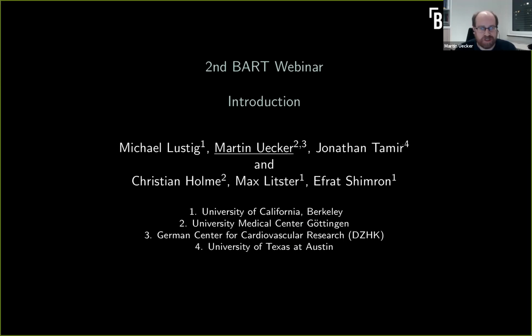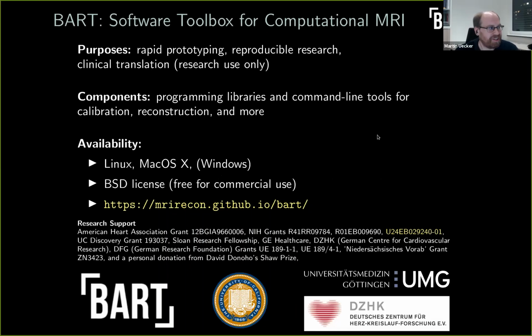Okay, so it's also a pleasure from my side to welcome you to this second BART webinar. I would like to introduce you a little bit. As you all know, BART is a software toolbox for computational MRI. We designed it for rapid prototyping, for reproducible research, and for clinical translation of new computational MRI techniques.